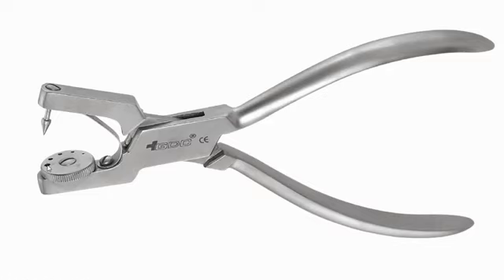Press it hard in one go, very important, because when you press hard in one go, a hole of similar dimensions will occur. If you don't press hard, what will happen? The hole won't be proper, तो शीट में lacerations आने के चांसेस रहेंगे. तो that's why जैसे आप पंचिंग मशीन यूज करते हैं, you punch in one go, so that the sheet exactly उस part में punch हो जाए. So you should go in one go. That is the tips and tricks which I'll be telling you when we'll be discussing the steps.